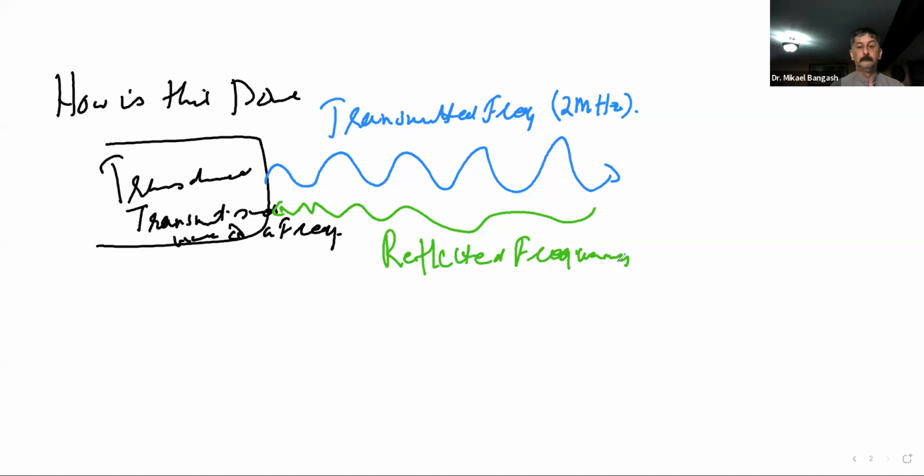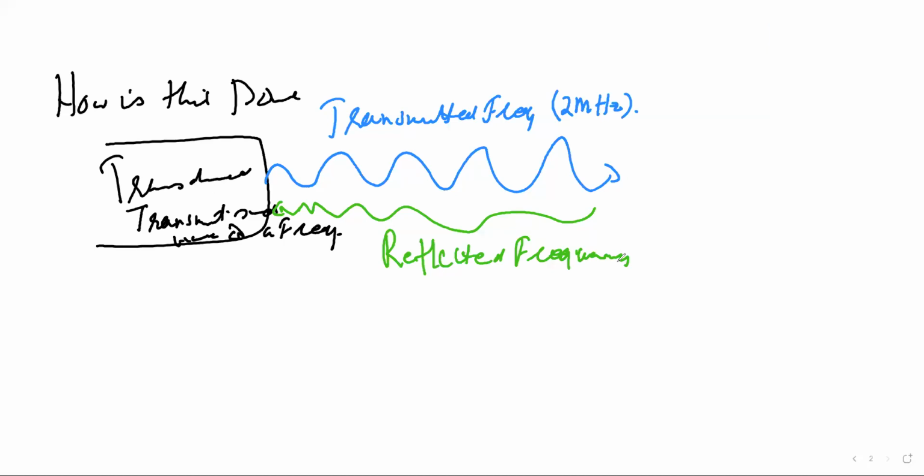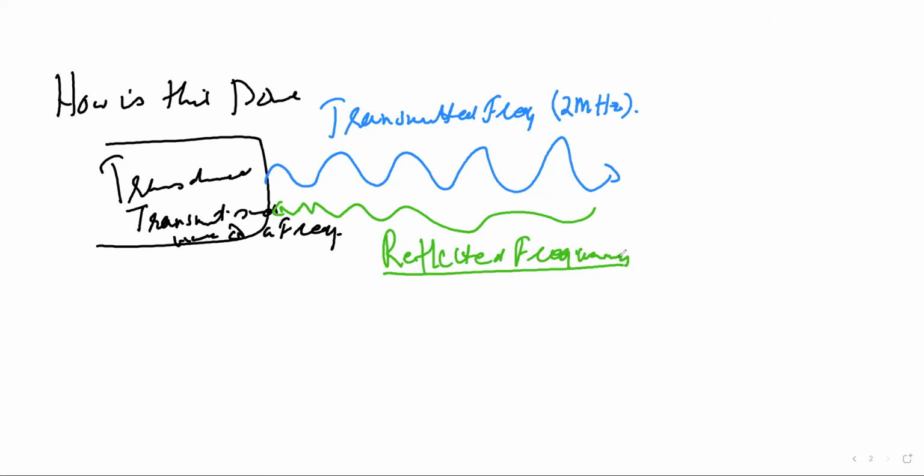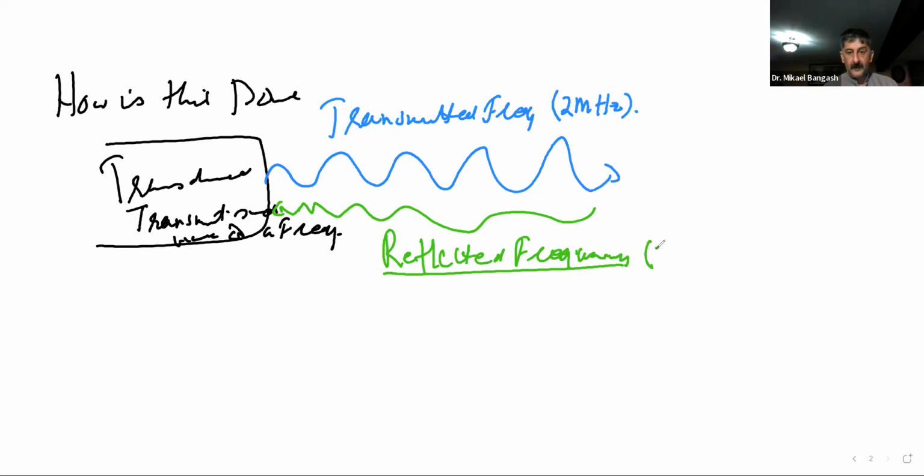Yes. Good. So the sound wave that's coming back is known as the reflected wave, so we are going to refer to that as the reflected frequency. Clear? Now, if this here was also 2 megahertz, that will mainly mean that the structure here that was being scanned did not move.